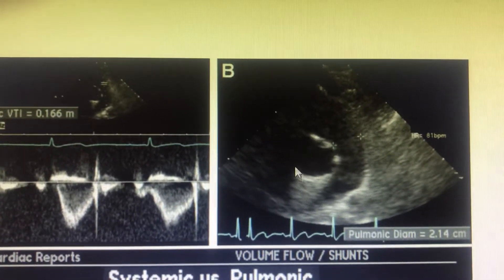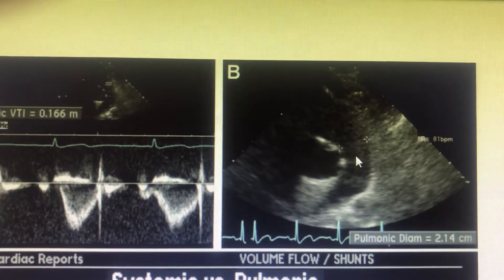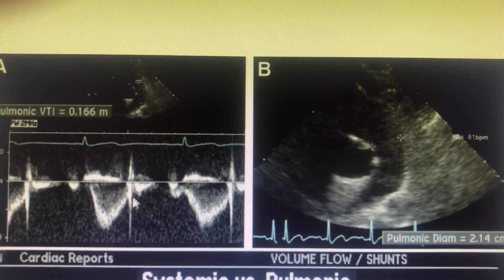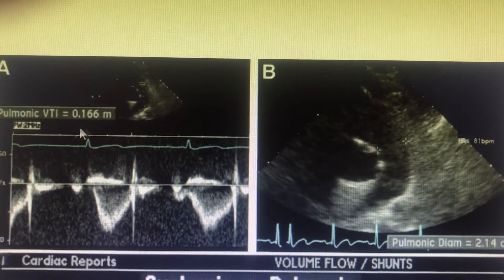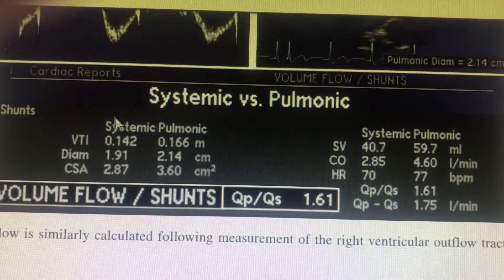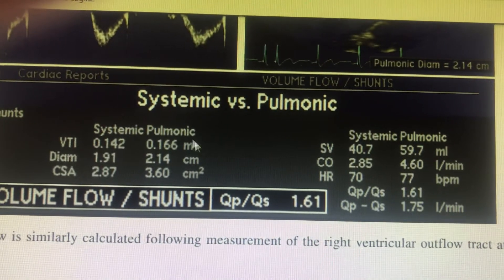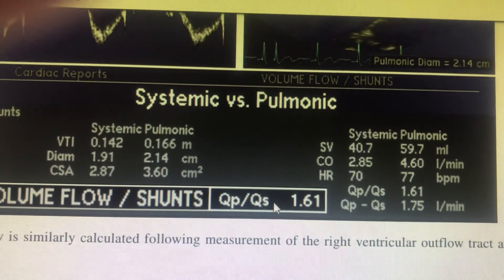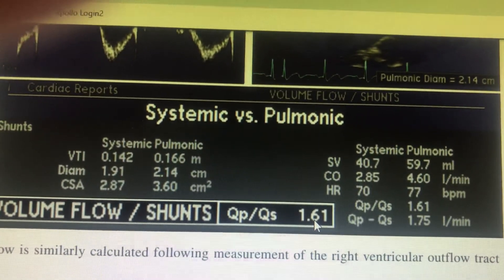Similarly, Qp is calculated by going to the short axis in the aortic view, where you get the pulmonary artery opening view. You measure the diameter, square it, and then get the VTI across it using pulsed Doppler — VTI being the area under the curve. The cross-sectional area multiplied by VTI gives Qp. So Qp/Qs equals cross-sectional area times VTI for pulmonary divided by cross-sectional area times VTI for systemic. In this case the result is 1.61, which is greater than 1.5, indicating a left-to-right shunt.